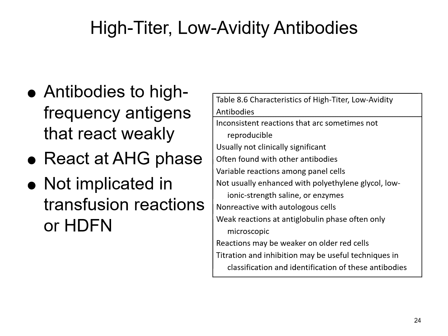Your auto control isn't reacting, so it's like just a mystery. You're trying to figure out what's going on. Then you're going to get weak reactions within your antiglobulin phase that sometimes can just be microscopic. You're not really seeing it. You may pick this up on gel, because gel is way more sensitive, but most of the time you're going to see these weird variable reactions, and you're really not going to know what to do.